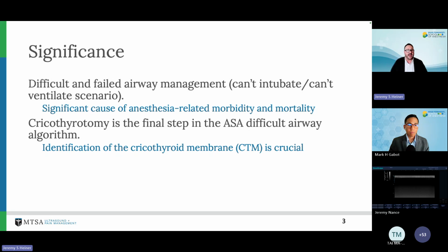And I'm going to invite my fellow presenters here today to jump in and let's talk a little bit about these airway algorithms. Certainly with the new updated 2022 ASA difficult airway algorithm, there are a couple of major changes.